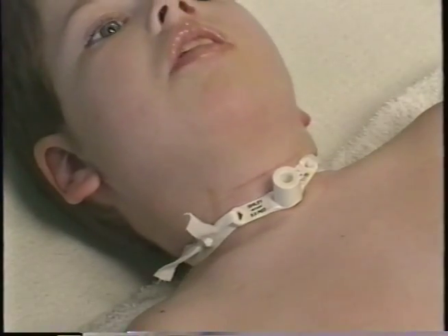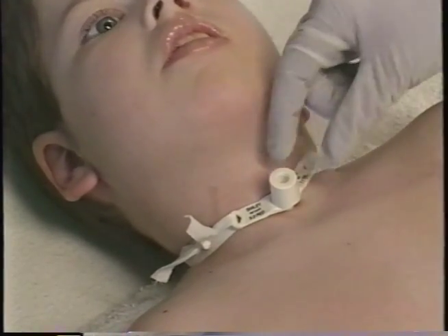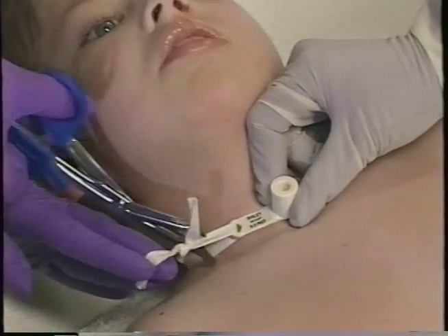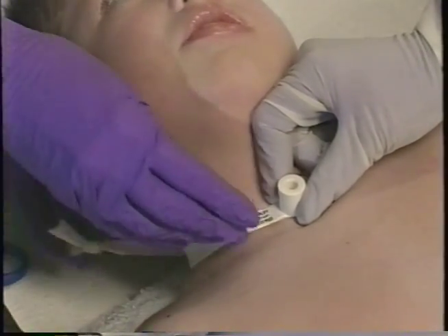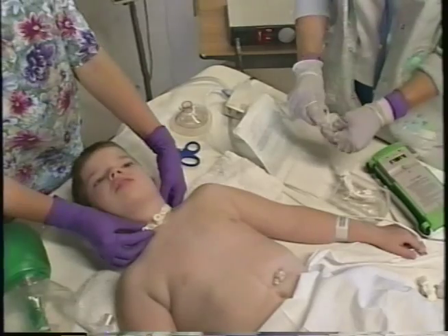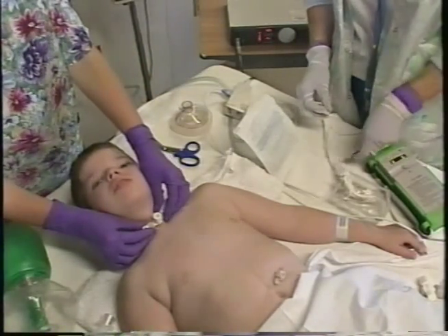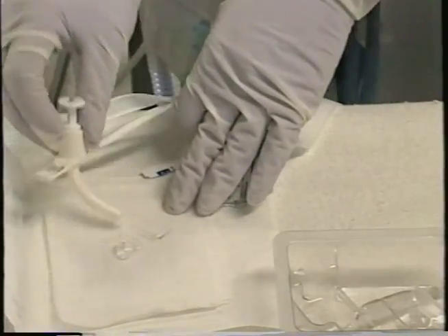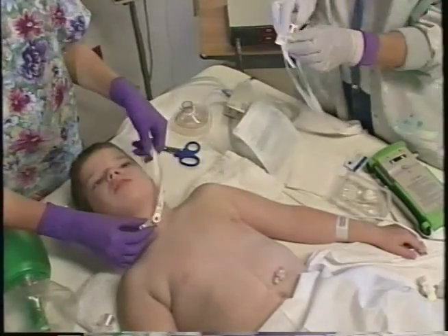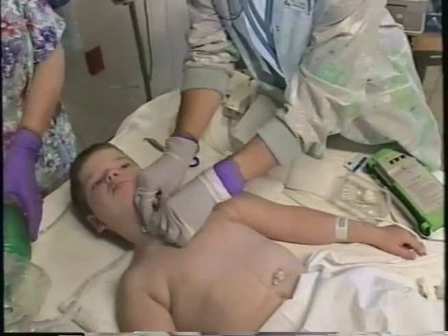On the child, either cloth or Velcro ties commonly hold the tracheostomy tube in place. If time permits, ensure the replacement tube has the ties attached prior to insertion. Remove the ties that hold the current tracheostomy tube in place and then remove the tube. Lubricate and gently insert the replacement tube into the stoma with the curve pointing downward, following the natural curve of the stoma.